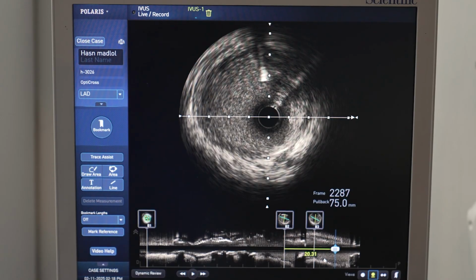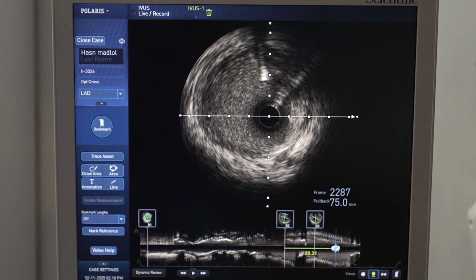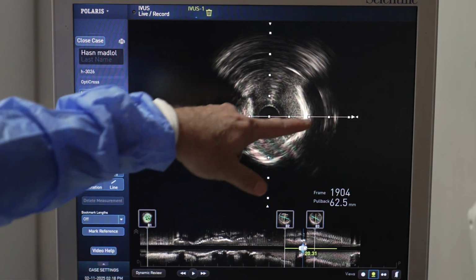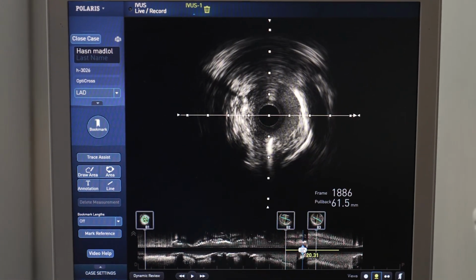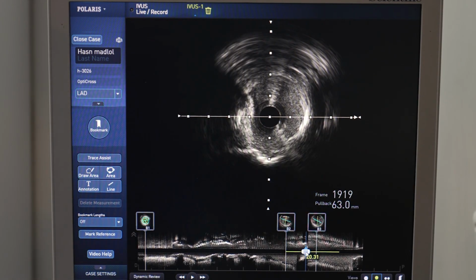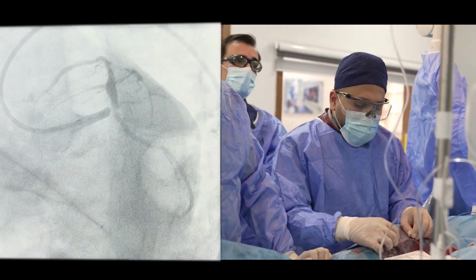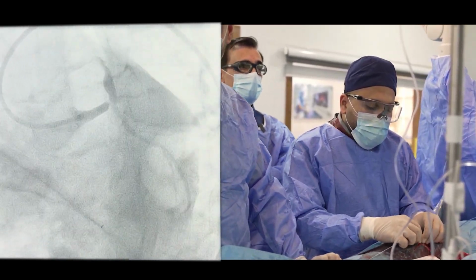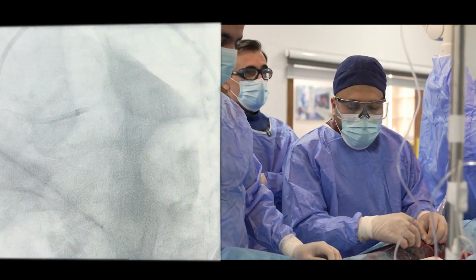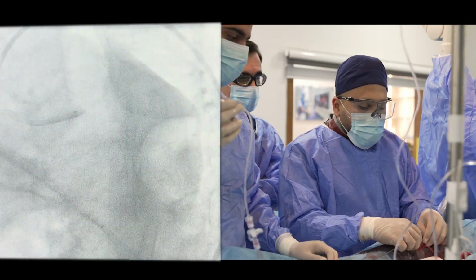Okay, now we have all the information. We need the further dilatation of the distal left main stem. Let's see if we can crack this part. So we have to take, do we have a cutting balloon? So maybe we take a cutting balloon 3.5. This is the largest cutting balloon we have. Okay. We're taking a Wolverine cutting balloon, Wolverine 3.5 15. Let's see how compliant is it.